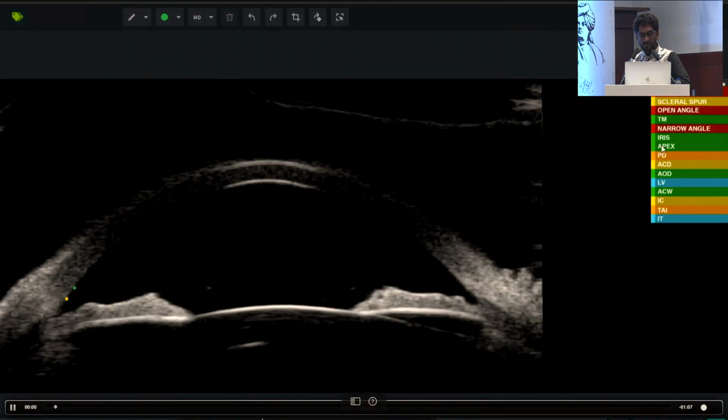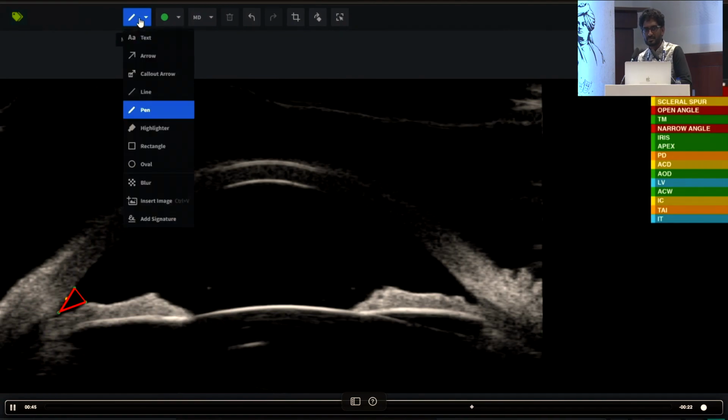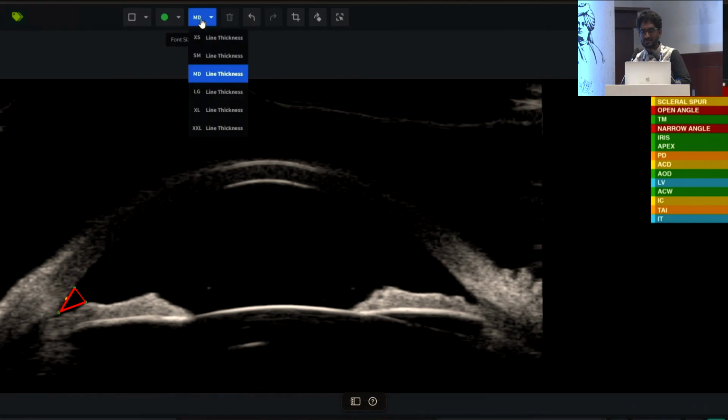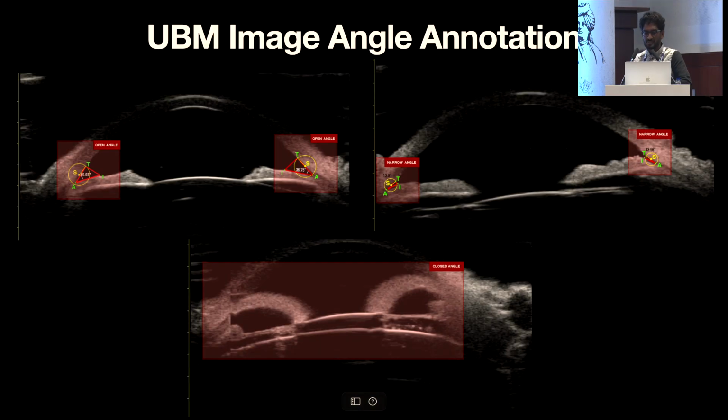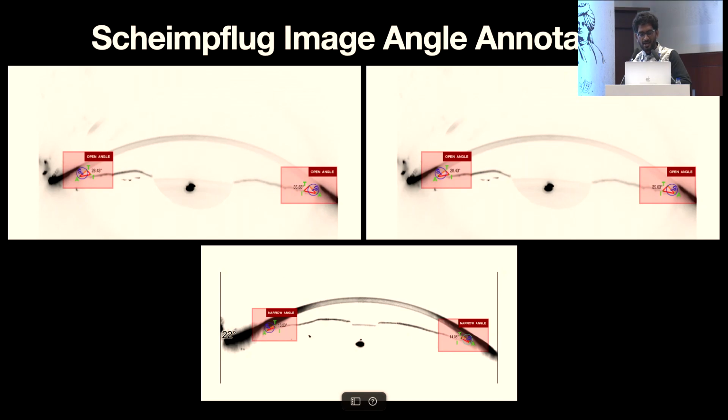Now we are working on anterior segment protractors for diagnosing: where is the trabecular meshwork, the green dot that you can see, then identifying where the scleral spur is, then getting your protractor there. Though there are many angle protractors now with the MIGS that are coming in, when you open up the angle, which I'll be showing next, we need to invent and reinvent ourselves because there is more to understand in this region after you do the procedure. So we are pushing ourselves with UBM, Anterion, ASOCT and Scheimpflug imaging.